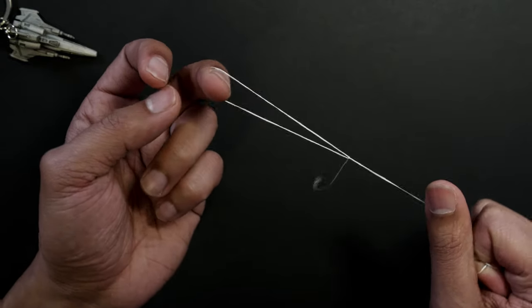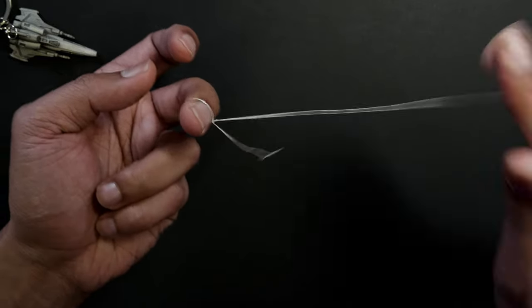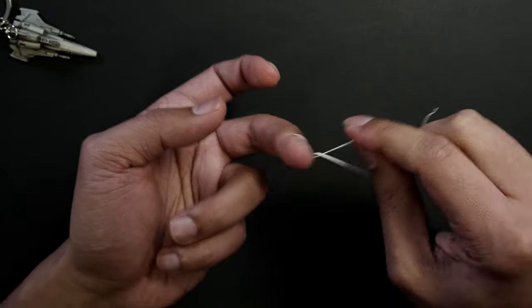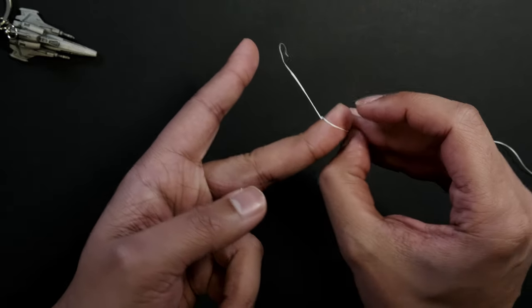Now the advantage of this one is if you pull on that, it gets smaller. You pull on that one, it gets smaller. You can get it really tight just by pulling on it with one finger.